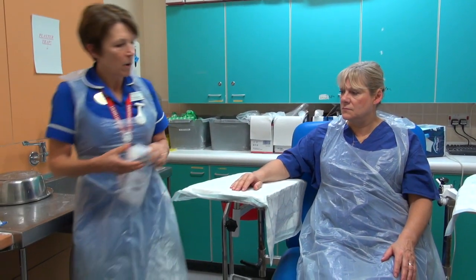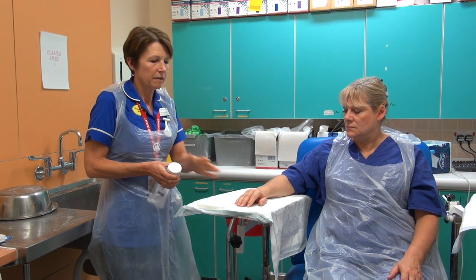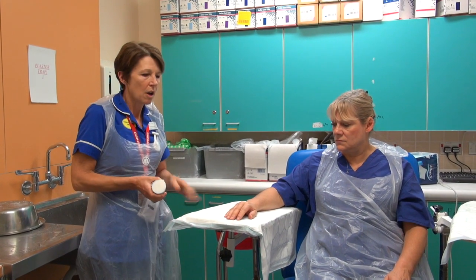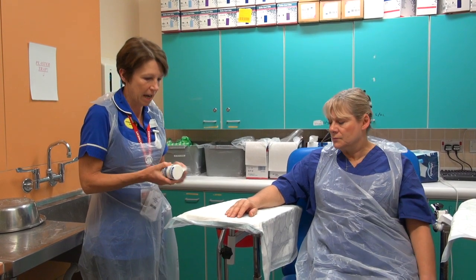There are two reasons why we can put a below-elbow back slab on in our department: it's for a fracture to the wrist area — so a distal radius or ulna fracture — or it could be for a suspected scaphoid fracture.